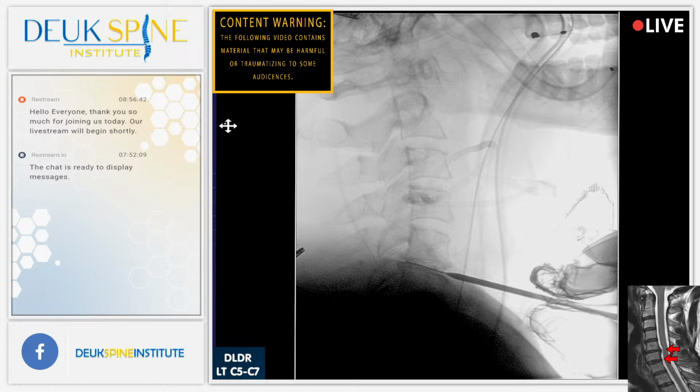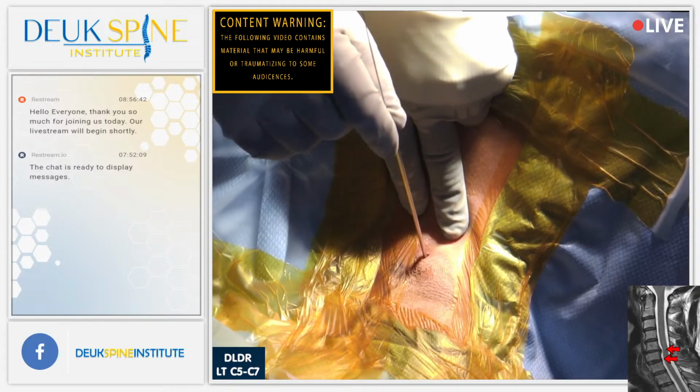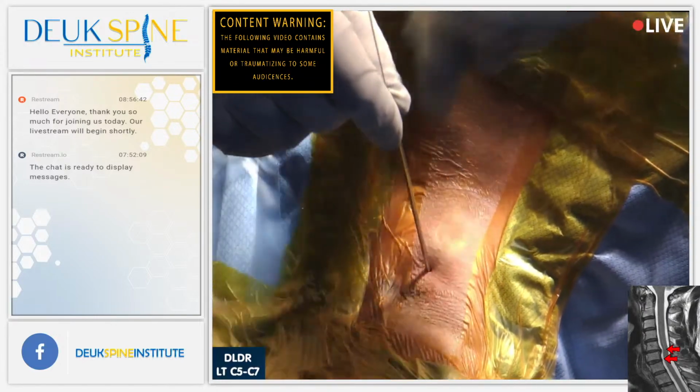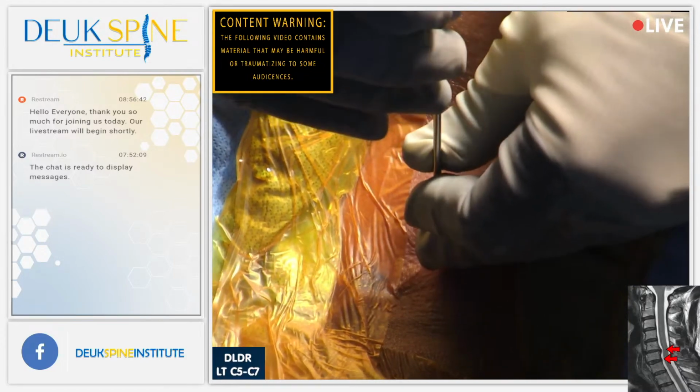And I know it's this very small amount. Now take a look here, guys and gals. See the little hole, the incision around this tube right there? Yes, there's just enough room to get a little bit larger tube in. And that's the tube we're going to do the surgery with.